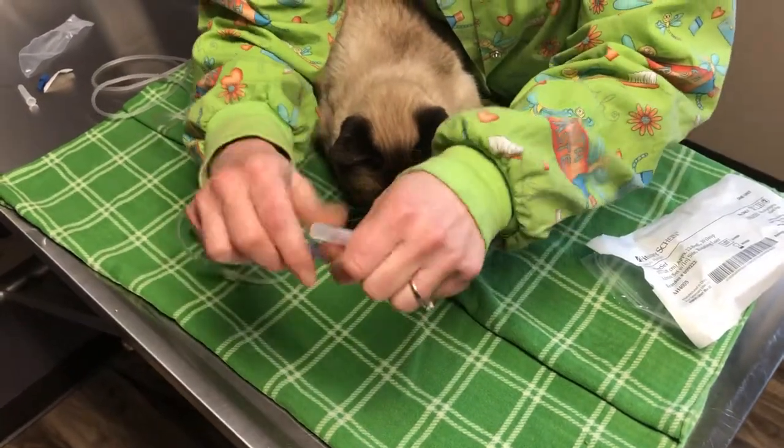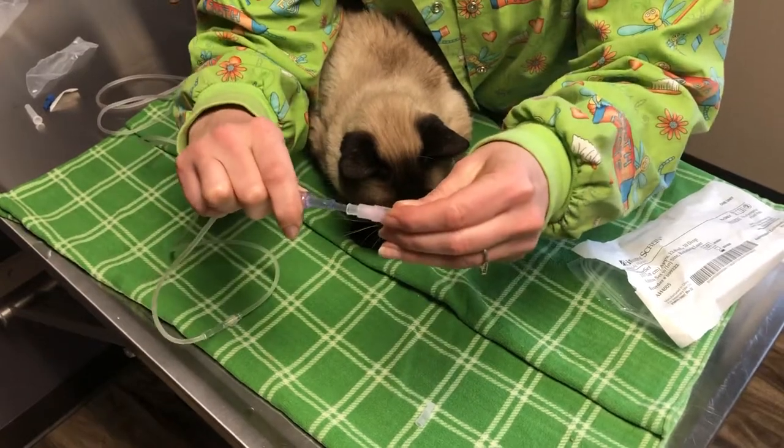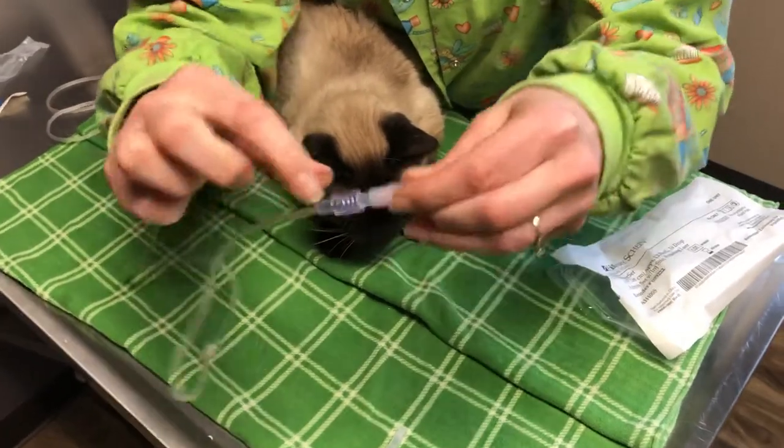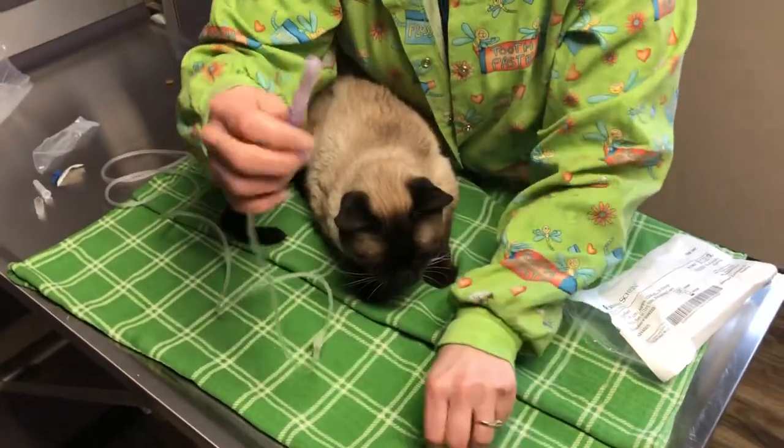There's a little safety cap on the needle that you just take off. You hook the two together and this goes straight through — and that's straight.